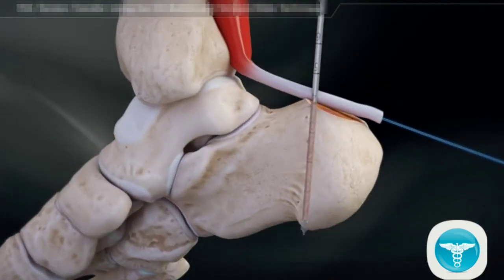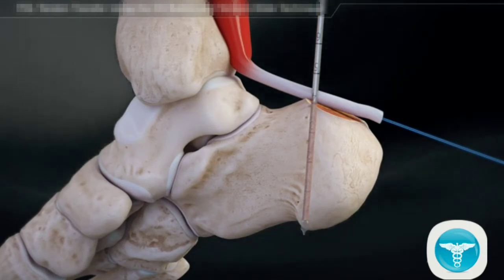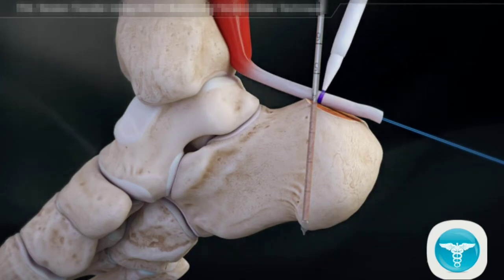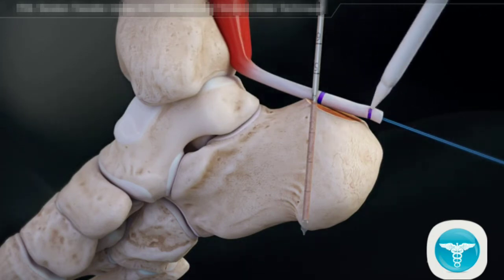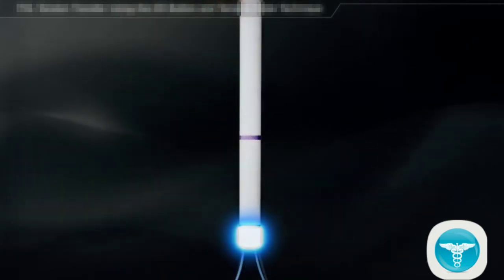Plantar flex the foot and pull the traction stitch so the FHL is tensioned appropriately at the interface of the bone and drill pin. Use a marking pen and mark the entry point of the tendon. Determine the length of the tendon that will pass into the tunnel. This will be either 15 or 23 mm, and make a second distal marking. Use an Alice clamp to secure the end of the tendon.